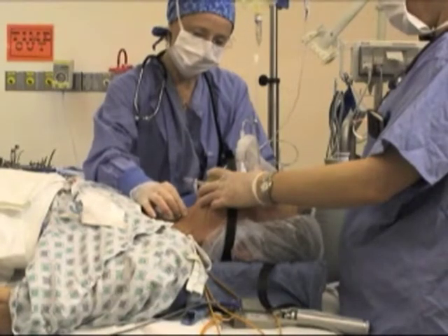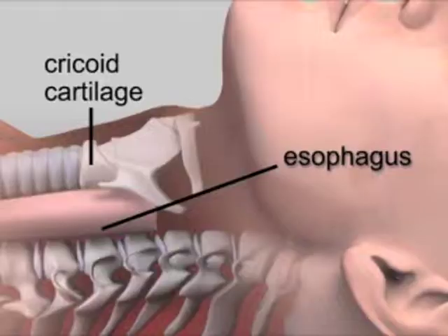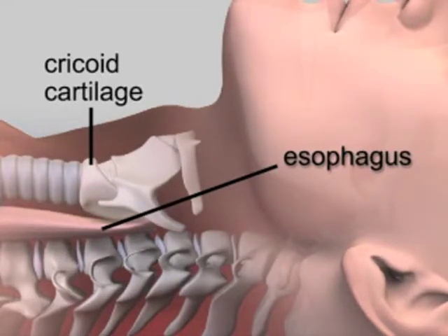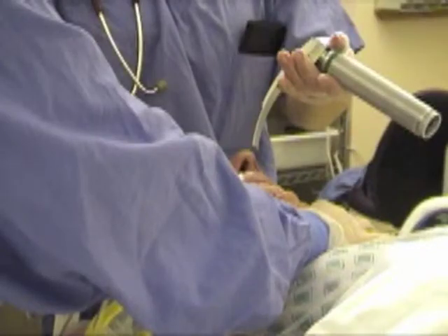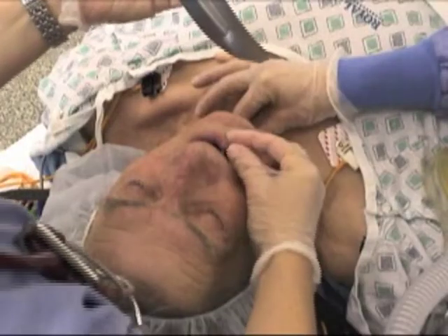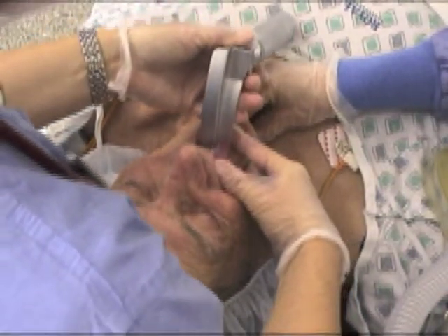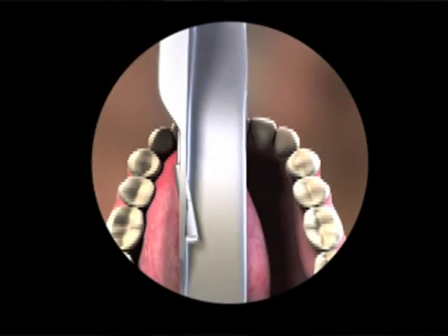An assistant should apply the SELIC maneuver by applying firm pressure to the cricoid cartilage. The SELIC maneuver compresses the soft wall esophagus between the cricoid cartilage and the cervical vertebrae, theoretically preventing passive regurgitation of gastric contents. Position your body so that your eyes are at a distance from the patient that facilitates binocular vision. Hold the laryngoscope in your left hand, blade down. Open the patient's mouth with your right hand. Insert the laryngoscope blade to the right of the patient's tongue, then gradually move the blade to the center of the mouth, pushing the tongue to the left.